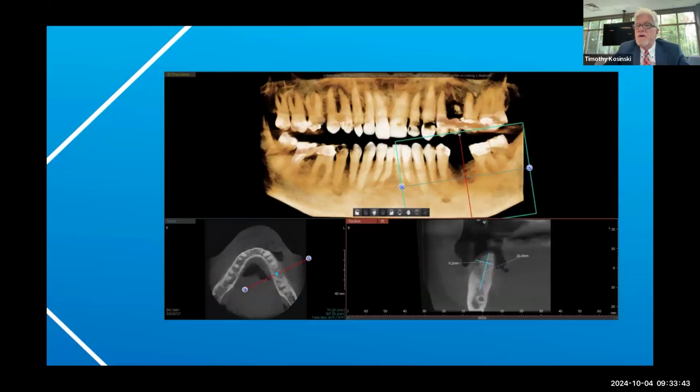In a short 3-month period, here we did a CBCT analysis, and I'm looking at my sagittal view of the site that I'd like to place an implant. Now remember, our initial stability with any implant system is in the apical 2 millimeters. Bone turnover occurs from the apex towards the crest. So even though I don't have complete maturity in the coronal 2/3 of this site, I do have bone turnover in the apical third, which will allow me to have implant stability.